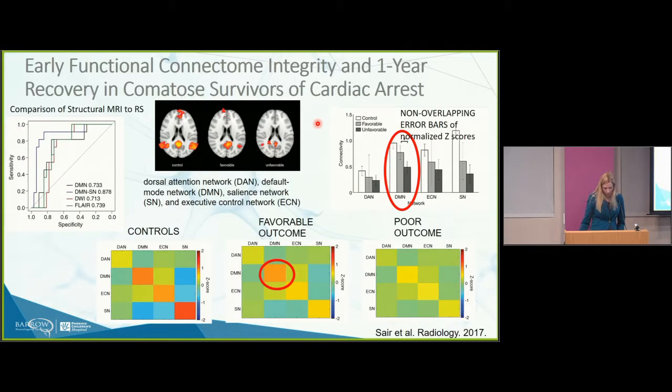Here is the picture of the default mode network, and here's what the default mode network looks like as our consciousness is degraded in human beings. Here's a healthy default mode network. Here is an unhealthy default mode network but still present, and here is a disappearing default mode network. If it's not detected at all, so far in individuals, as I've mentioned, they've progressed or already are brain dead.